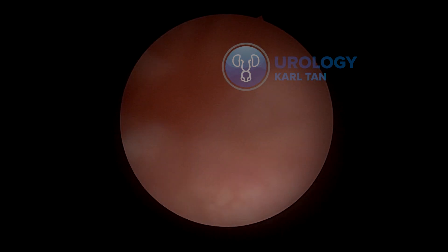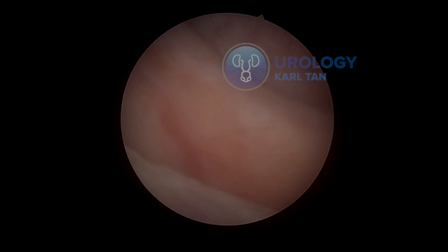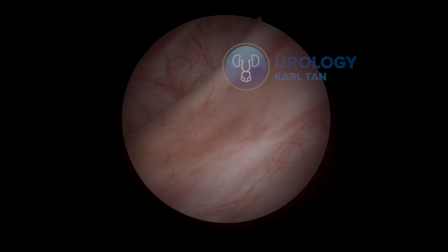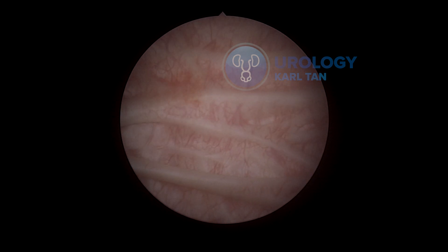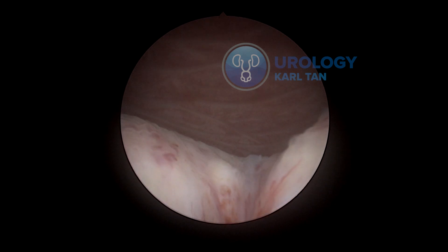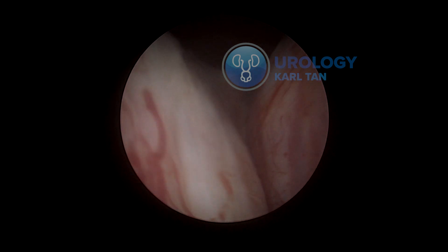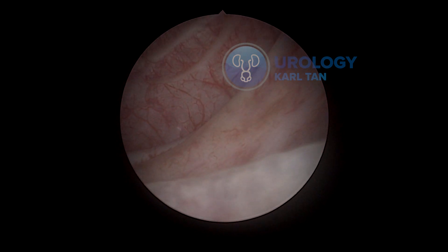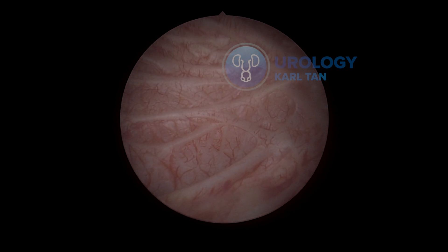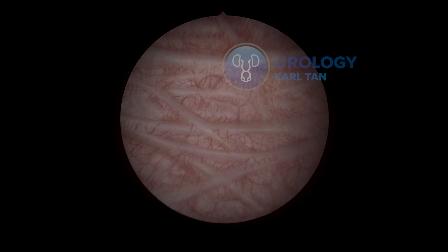I'm mainly using a combination of blunt dissection assisted by the thulium laser for coagulation and cutting through sticky parts of the adenoma into the capsular plane. My technique involves both techniques of Professor Sancha — the earlier apical release — and the reverse way of doing it from what Professor Scafone is doing with his enucleation.